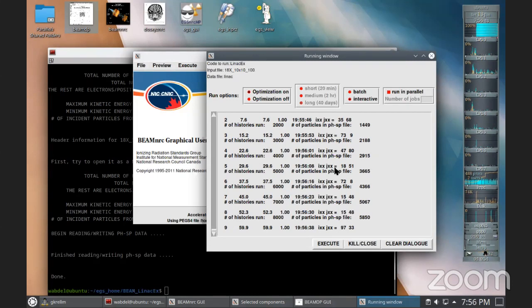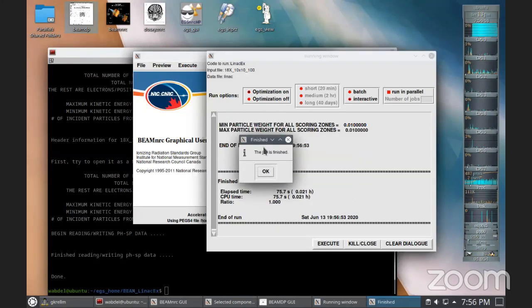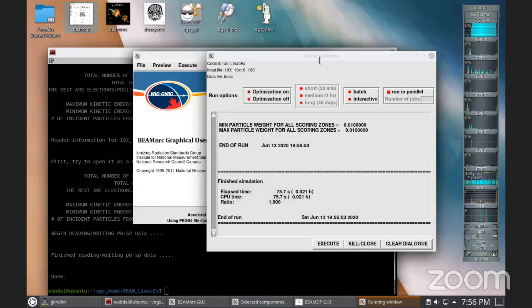Energy column. What do you want me to explain in energy column? Hello, sir. Yeah. Sir, actually, I have a doubt in this E cut and P cut and the energy column. So how is the energy getting reduced? It's the total energy of a particle. Yes, sir. So we selected E cut like 0.511. E cut has nothing to do with what you're talking about. So after that energy, it doesn't involve in dose, is it, sir?